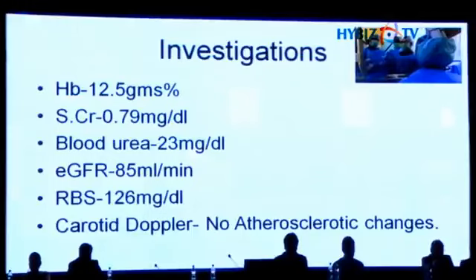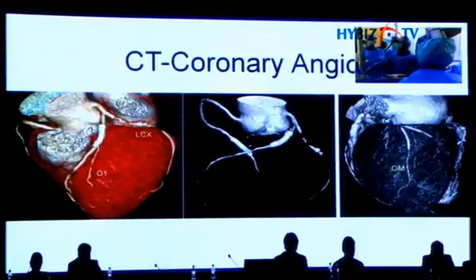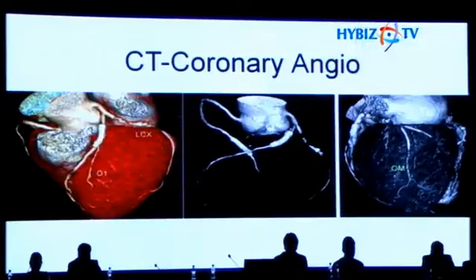We did the CT angio. You can see the CT angio films: well patent LAD stent and RCA stent. The LCX CTO segment is not showing any calcification. It's a fibrotic lesion ending at a bifurcation site, and the proximal portion of the LCX is also significantly diseased. You can proceed, sir.